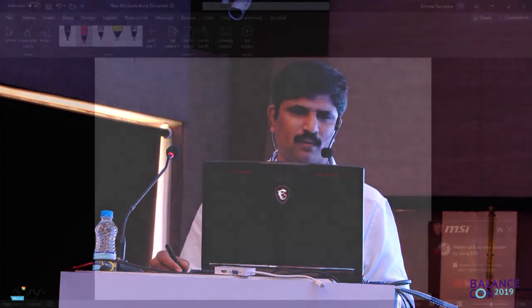So we'll proceed with the interpretation. Just to make sure that we are all on the same page, if somebody has not understood this particular thing, I can spend some time because this is very important, post which we will start, because most of us are not VNG users. So we should make sure that we understand this particular part before we proceed. Okay?